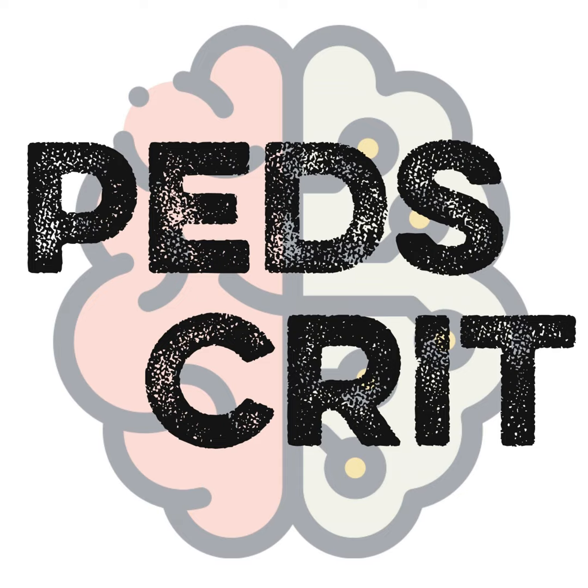Classically, many people will dial the power knob to titrate the amplitude, because if you increase your amplitude, you increase your stroke volume and improve your ventilation. But since we have adopted the approach of high frequency, high lung volume, high power, we are already at 70 to 90 centimeters of water.